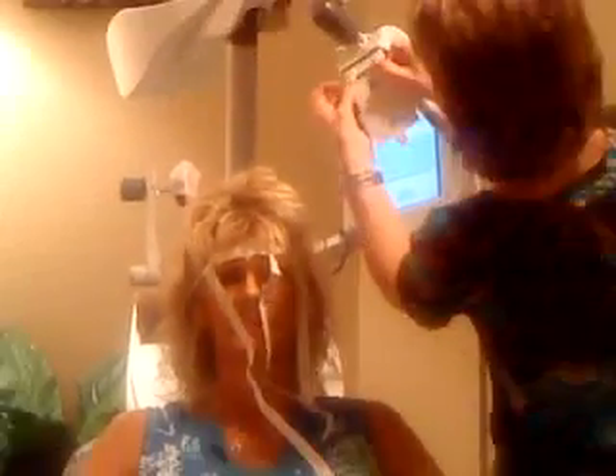This is what you heard Sam mention a couple of times — the disposable cost. This is a SINSTAR, something that has to be replaced each and every time, which adds some expense. The clicking sound you hear is just the magnet being released. It sounds more intrusive than it is.